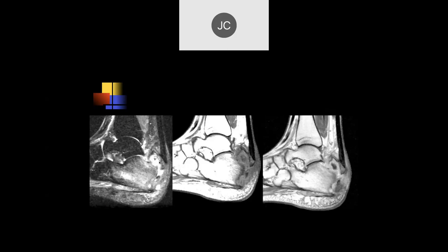Looking at the hindfoot, there's a lot of edema and the calcaneus looks like there's an avulsion with the Achilles tendon — a small osseous fragment. I'd be concerned for osteomyelitis. There's a lot of inflammatory change and a blood collection. You can see a lot of edema in the bone.